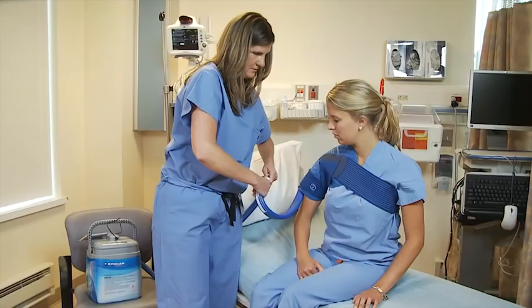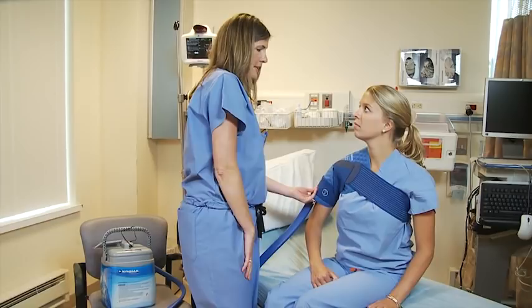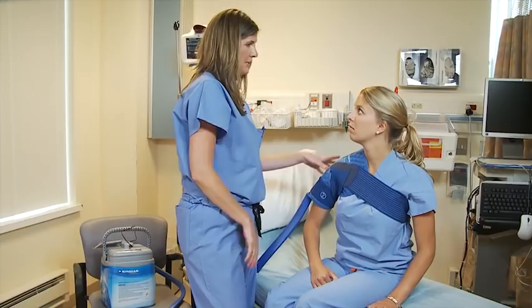In a few moments you're just going to feel cold. You never want to put this directly on your skin — you always want to make sure you have a t-shirt or some type of barrier between you and the pad. This is designed so you can use it continuously, because the temperature never really reaches a harmful ice therapy level — it's 46 to 52 degrees, so there's really no harm in ice damage. However, we do like you to take it off and inspect your skin to make sure the skin's integrity is in place. You can use this continuously, but you want to make sure it's not on the floor — have a chair or something lateral to the bed.